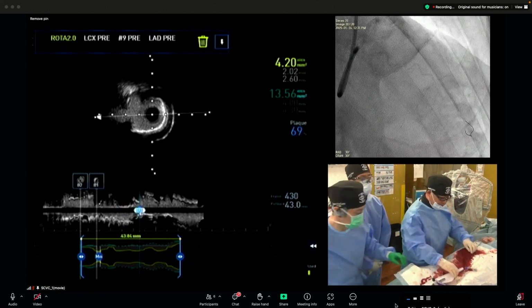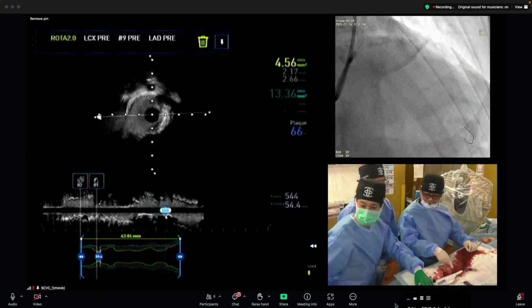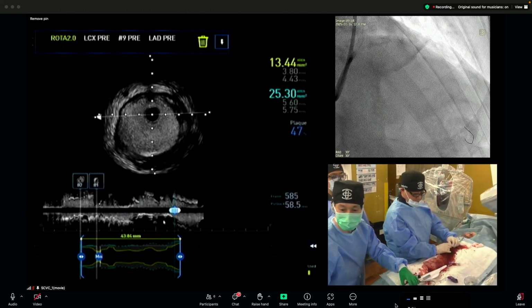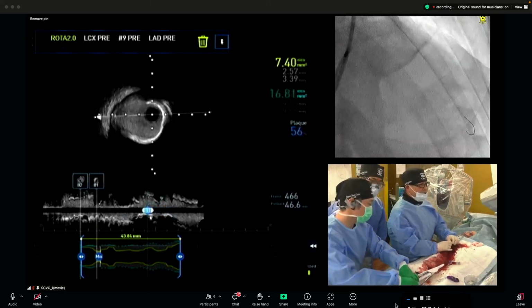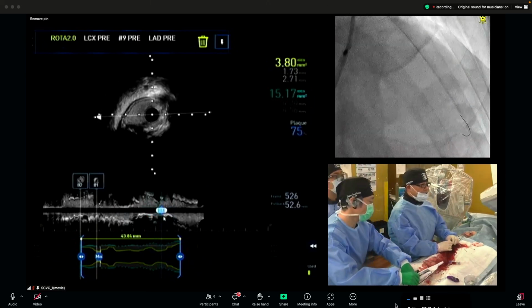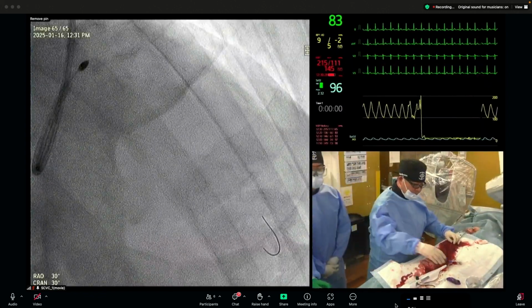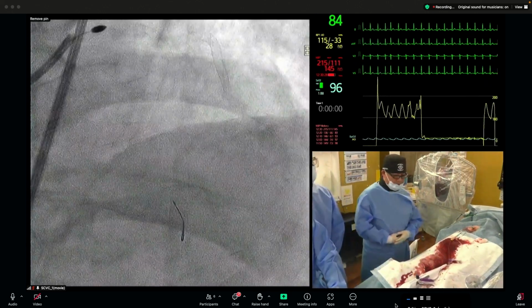And more proximal, is this circumferential? I always wonder about the eccentric calcification, and how much the efficacy is, but I found some improvement in the interlumen at the site of the diagonal bifurcation. It's a good sign. But is it good enough? I'm not sure.